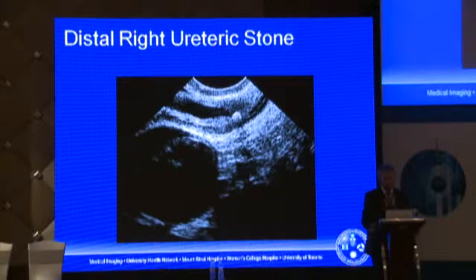So if we look at this woman using an internal scan, she had right-sided pain. Note the hemorrhagic cyst with retractile blood clot. You mustn't assume that that's the cause of the pain. And really, it's often the clinical history that will be the tip, because this patient had symptoms very typical of right-sided renal colic.